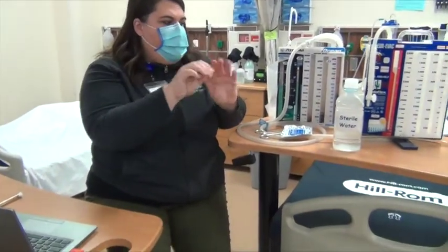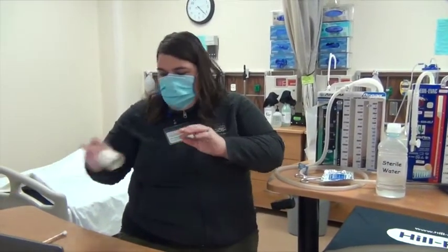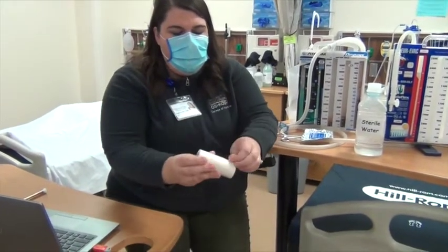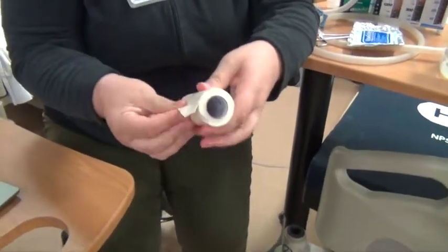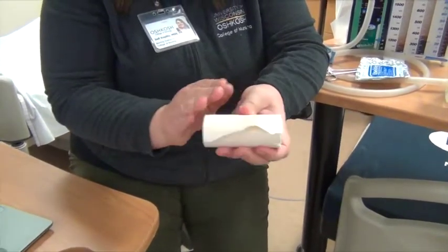you kind of wrap it around, and then you might put more 4x4s and then tape over with this kind of microfoam, which you can kind of see. It's flexible, and sticky, and that will go over the whole site as well.